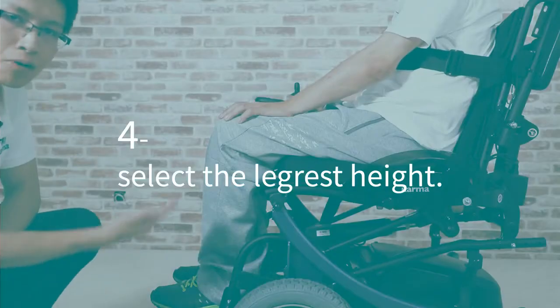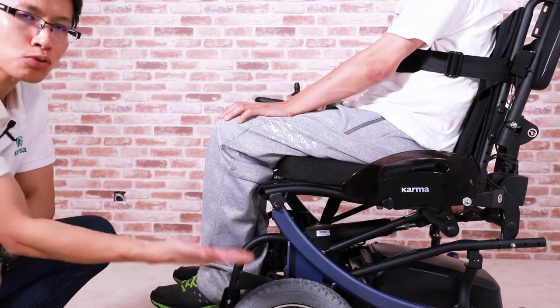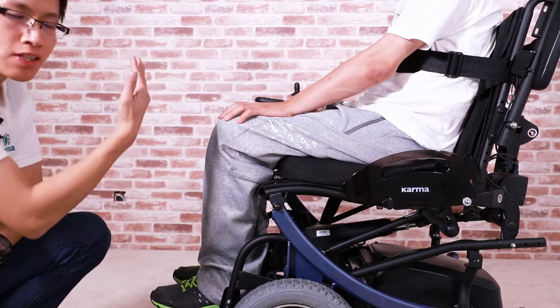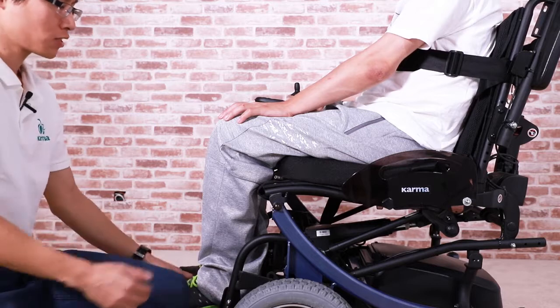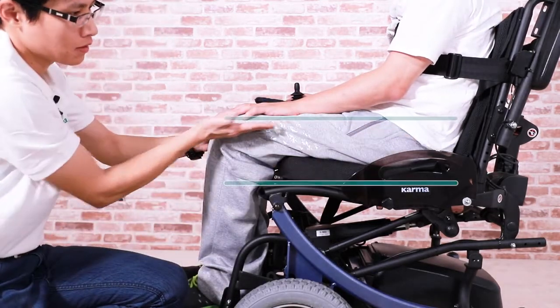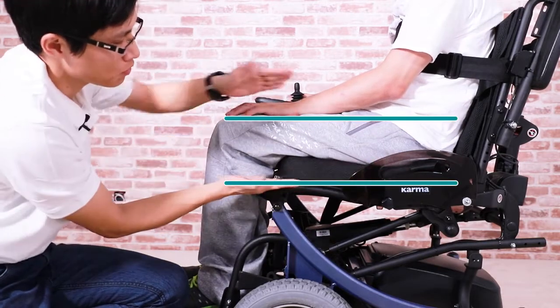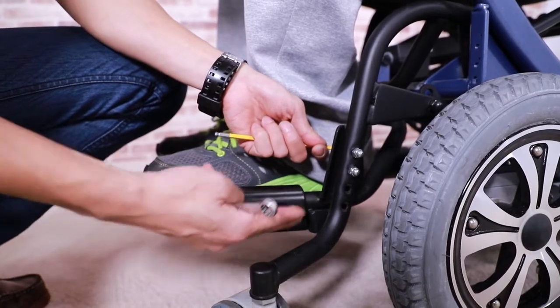Now, we adjust the leg rest height. A good leg rest height can make the entire standing process smoother for the user. What is a good leg rest height? First, the foot plate must support the limb enough so the thigh is parallel to the seat frame. We have several leg rest height options on Ergo Stand.